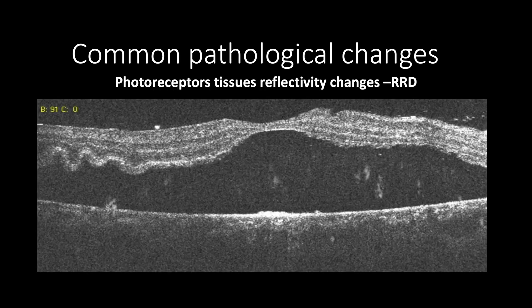This is a case of inferior retinal detachment involving the center of the macula, showing subretinal fluid with disruption and increased reflectivity of the ellipsoid zone located temporally.